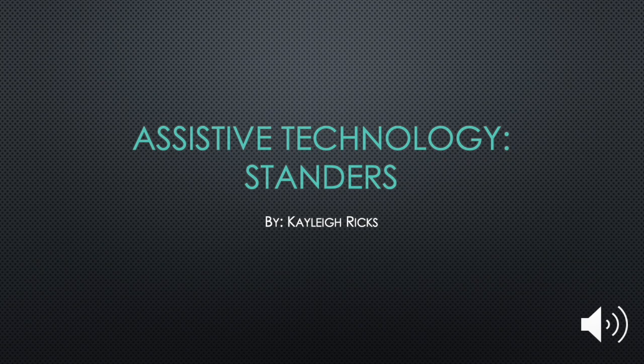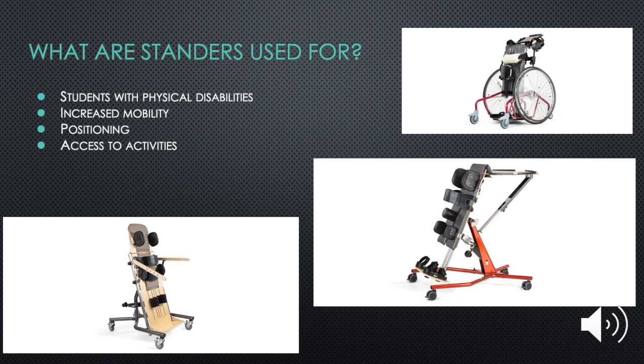My name is Kaylee Ricks, and I will be talking about a type of technology called standers. There are three different types of standers. You have mobile standers, prone standers, and supine standers.